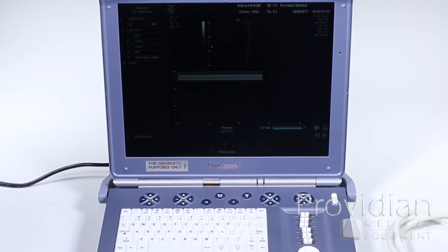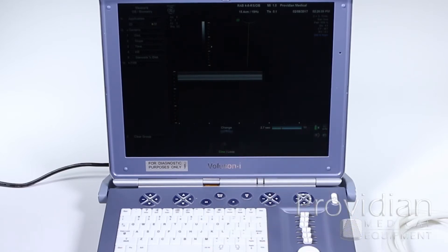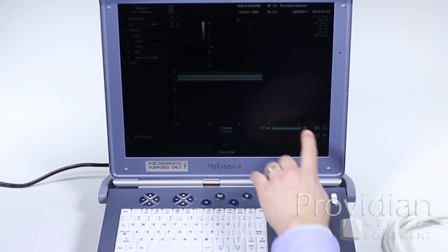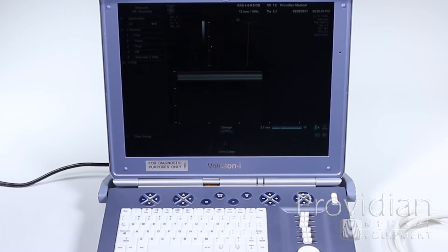You can freeze the image and use the same Cine review as before. Using the options, you can scroll through the image. This shows that I have 2.7 seconds of a loop that I'm going through.